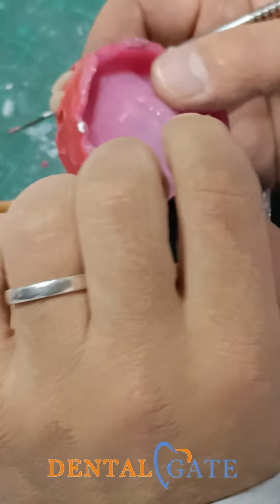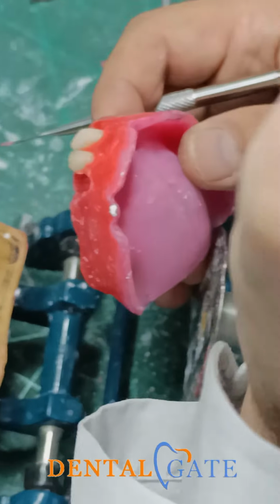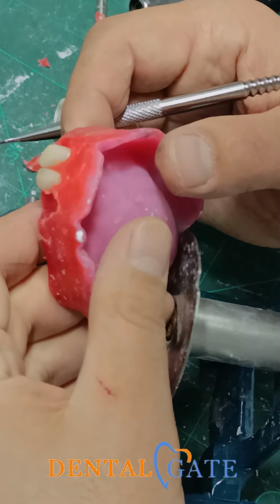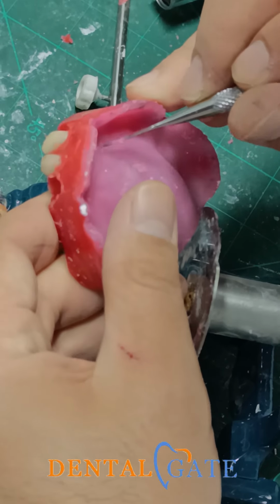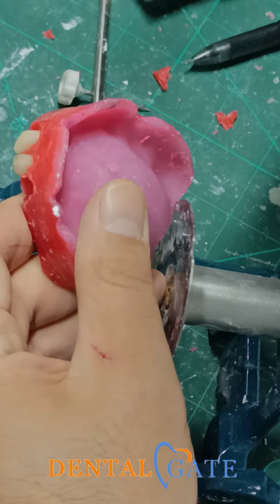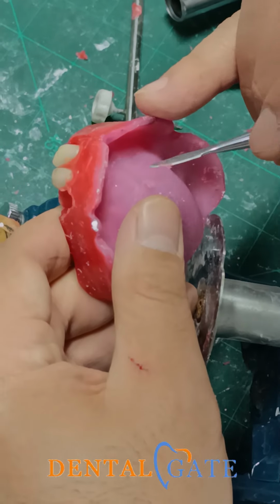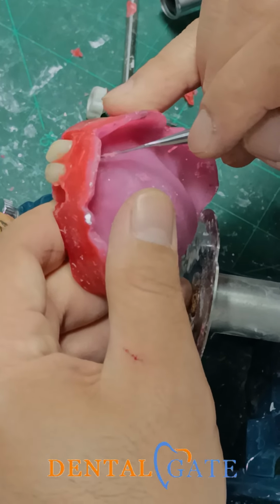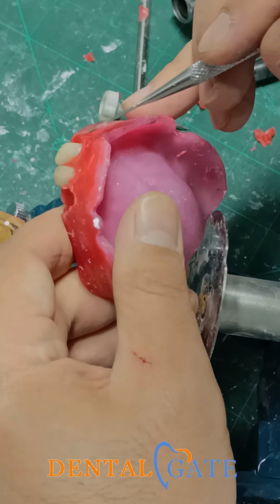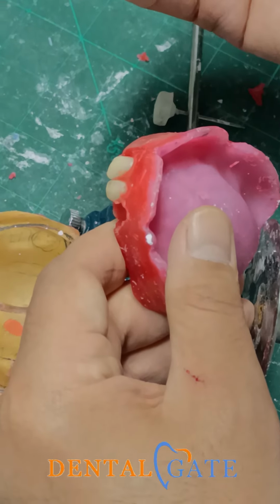Please, this is one note here regarding the central incisor. Okay, if you want to make an ideal position for the central incisor, if we have a patient's mouth, it should be positioned in front of the incisive papilla by about 8 millimeters. We have special tools to measure this length, okay? But generally, if you don't have the tools, you can make a double check of the central incisor. It should be in front of the maxilla, in front of the incisive papilla.